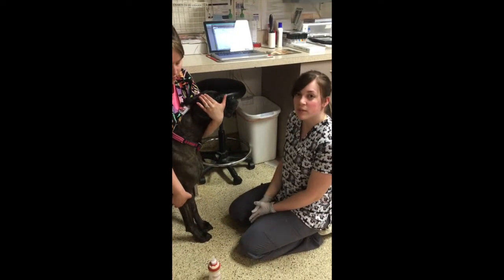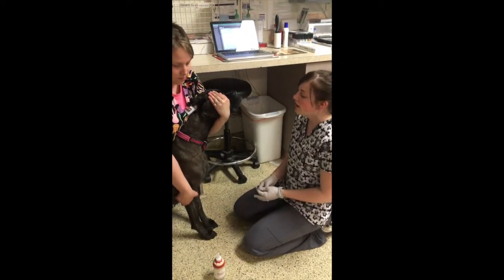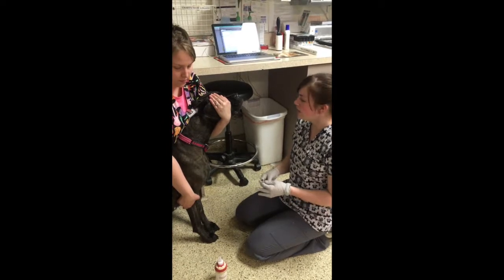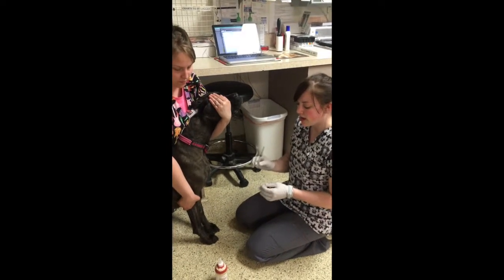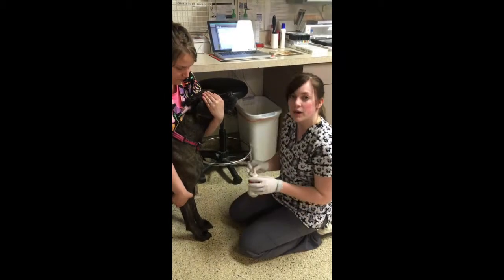Alright, this is Ellie, and we're going to be drawing blood on her. We're going to be using the cephalic vein for this blood draw. My assistant is holding off the vein for me. So what we have are all the things I need. I have a 3cc syringe with a 22 gauge needle. I have my alcohol, and I'm wearing my exam gloves.